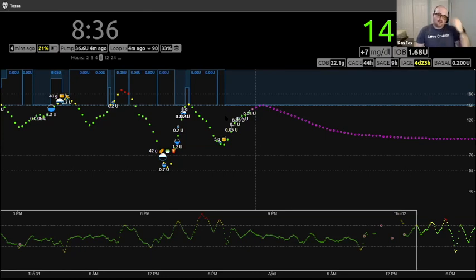I kind of like the icicle one because when you're using the temp basal rate functionality within Loop and the basal rates go higher, you're getting more insulin, right? So I like to see the bars go down, like they're pushing down on the CGM numbers. So in my mind, it's like trying to push blood sugar down, but I don't know. I like to share that with people, but it's fun.